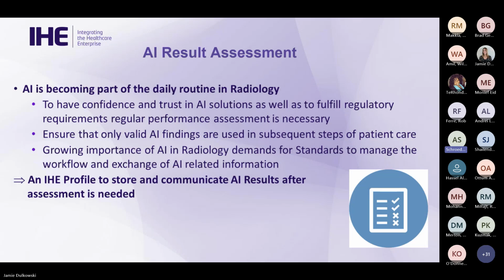And also we want to make sure that for subsequent uses in clinical routine, only valid and evaluated AI findings will be used, and not just everything which is created by the AI. So with that, we thought it would be really important to develop a profile which could encode the outcome of these assessment processes, which then will be part of the AI radiology portfolio, as you perhaps can see on the next slide.